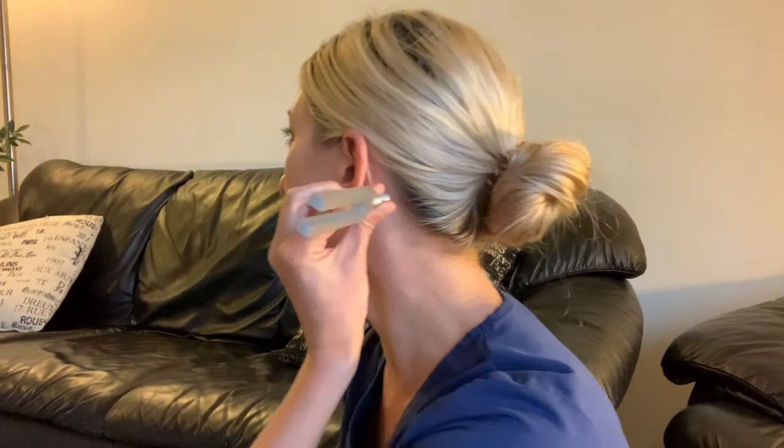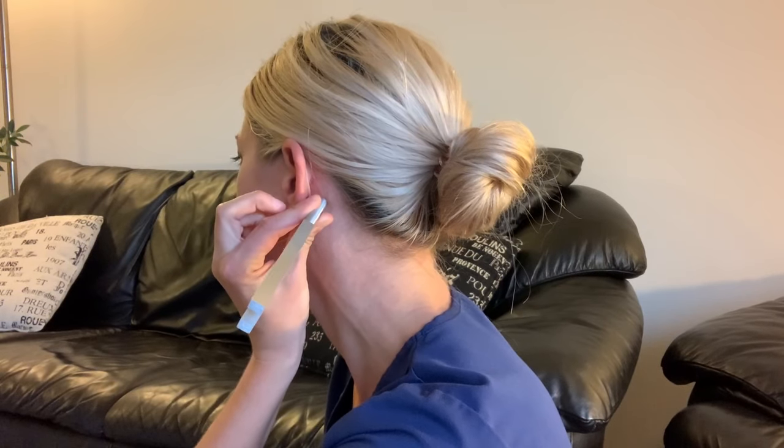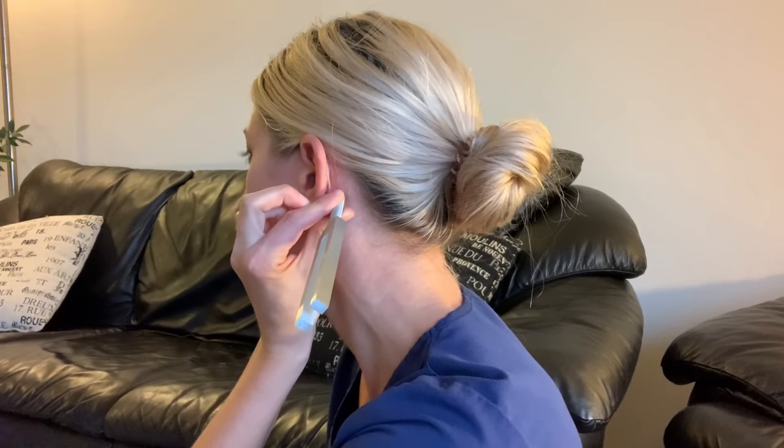Now we're going to do the left ear. I'm going to activate it on my knee and hold it on the mastoid bone. I can no longer hear it, so I'm going to move it to the outer ear. The left ear is also normal, or a positive Rinne test, which means that air conduction is approximately two times that of bone conduction.